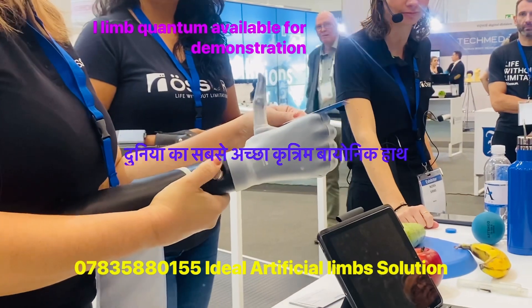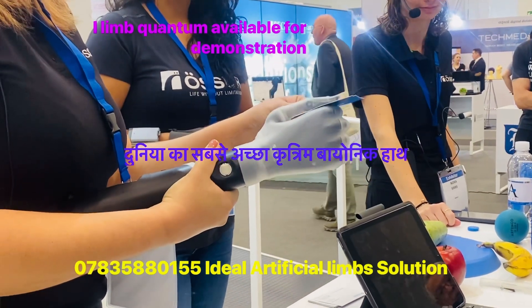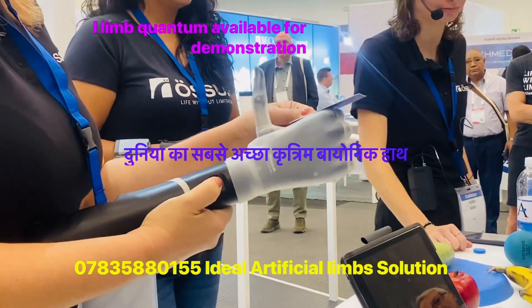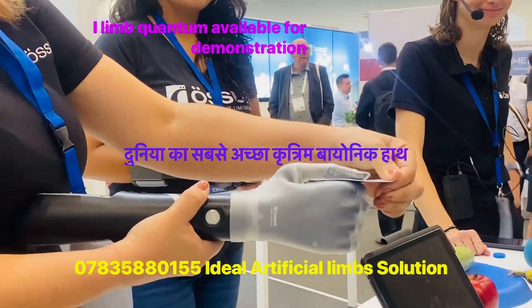The lateral pinch is very useful to grab cards, money, keys, plates — to serve himself in a restaurant, for example, in a buffet restaurant. So very useful and very powerful.